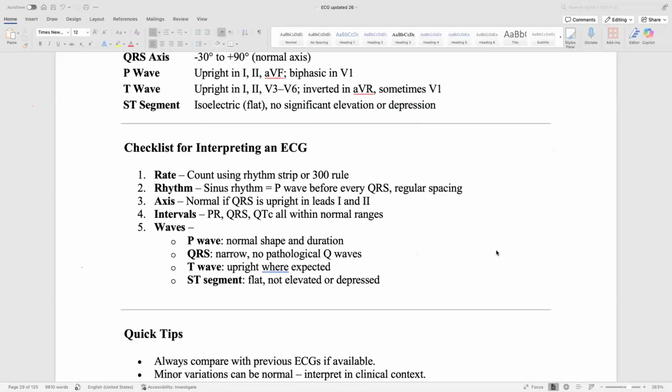Patient has shortness of breath, everything is normal, X-ray is normal, blood gas normal, because in pulmonary embolism, the blood gas will not be abnormal unless it is massive. Sometimes you will even have alkalosis in the arterial blood gas. The only abnormality may be the sinus tachycardia. Okay.